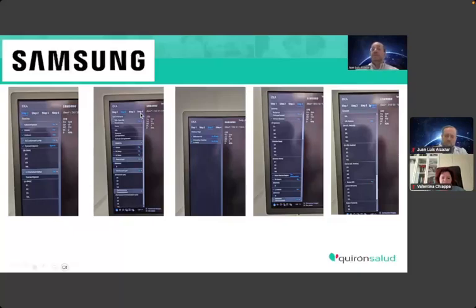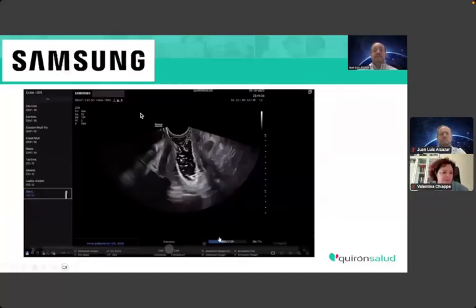And then finally, you go to the posterior compartment lesions. You can detect the presence of nodules in the uterosacral ligament, right or left, or the torus uterinus, measuring them. Or bowel disease, measuring the lesions in the lower rectum, upper rectum, sigmoid, and also obviously in the rectovaginal septum. And here you will see real-time scanning and the use of this protocol inbuilt in the machine.